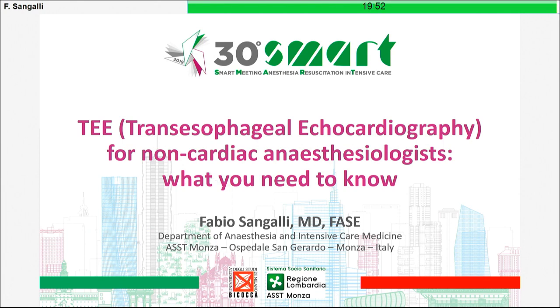That's actually just happened to me recently when blood transfusion just led to a suction cascade, and that was dealt with inotropes under echo vision. I think I'm one of the rare anesthetists who actually experienced cutting through the drive line, fortunately in the cardiac anesthesia setting. And our surgeon started to rewire the different, I think there are 12 wires. I offered a bottle of champagne if that worked, and indeed it worked. In response to that, the company actually now has a connector which allows this to be done more rapidly. So I think every non-cardiac center should have that connector.